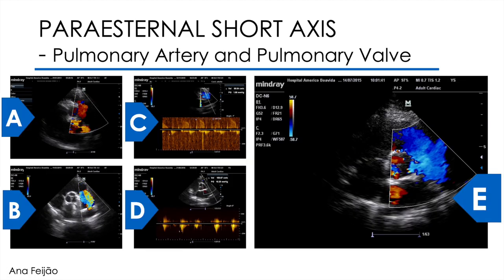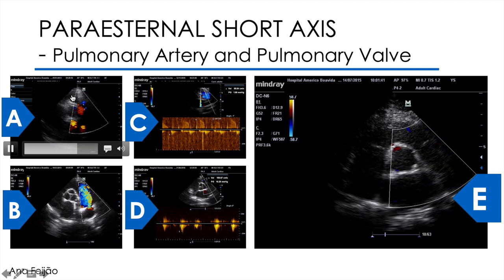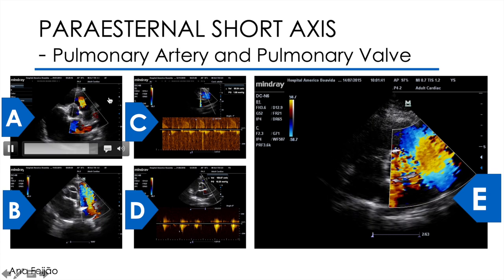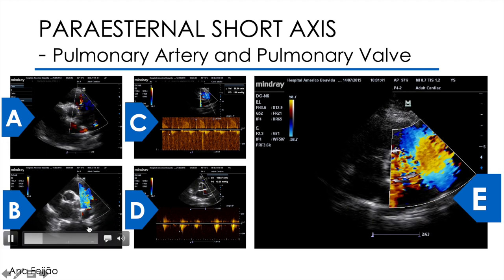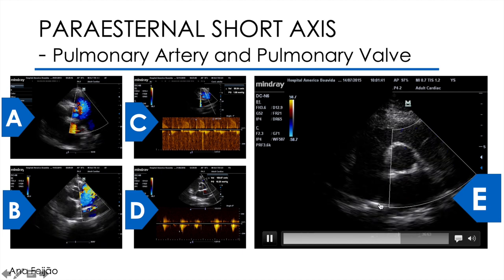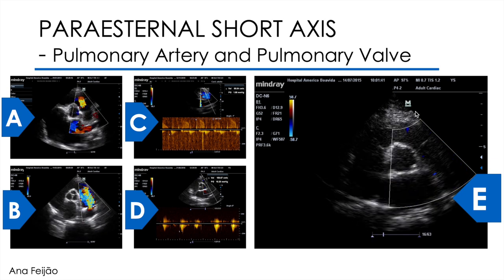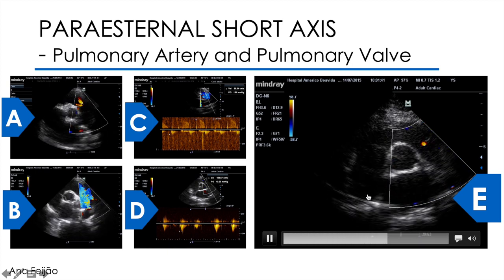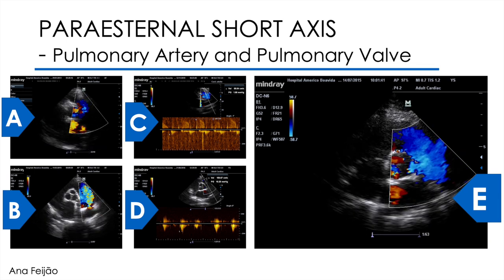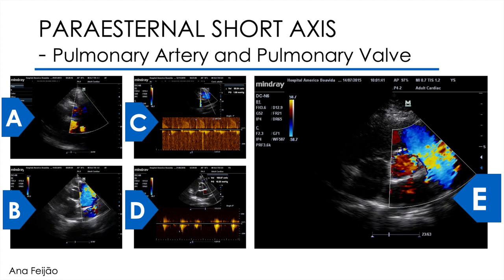To finalize the evaluation of this area, I add some color. First, I access the flow of the pulmonary valve. I call the color Doppler window, lower the general 2D gains, orient the size of the sector so that the pulmonary valve is in the middle, and orient the color scale to a velocity around 50 to 70 centimeters per second. With very low color Doppler velocities, we set a low limit for aliasing — visually we will not have as good a perception of the flow dynamics. But being in a cardiac zone with low velocities, it is also advisable not to set very high velocities as we lose track if there is any flow altered at low velocities.